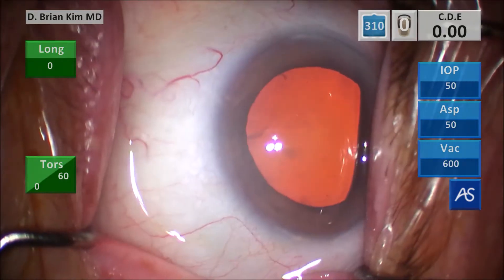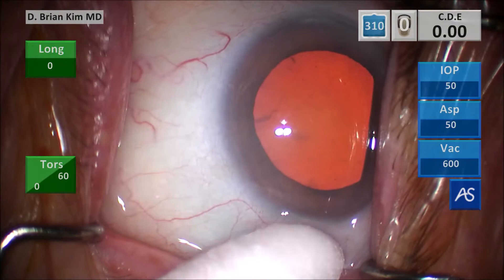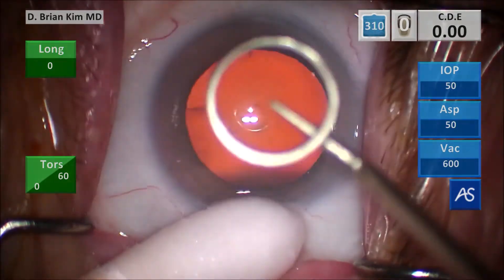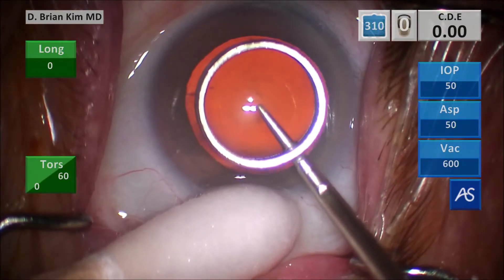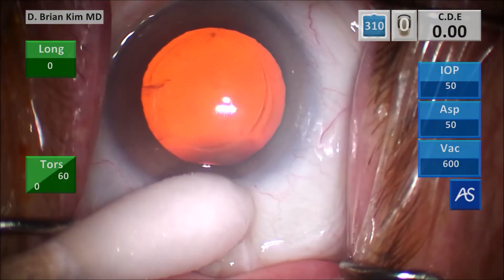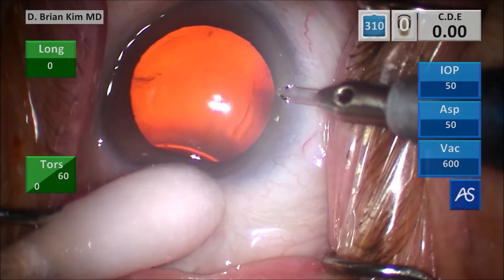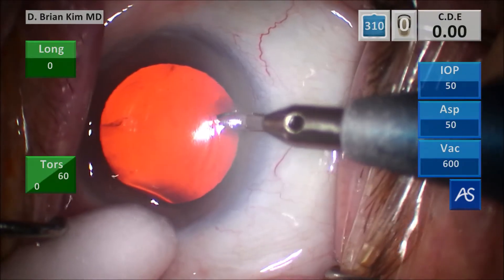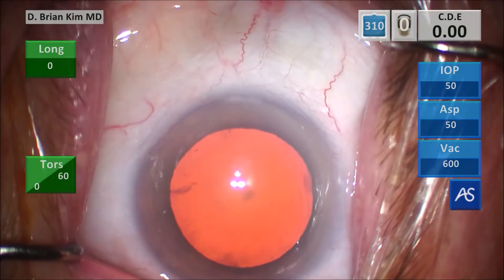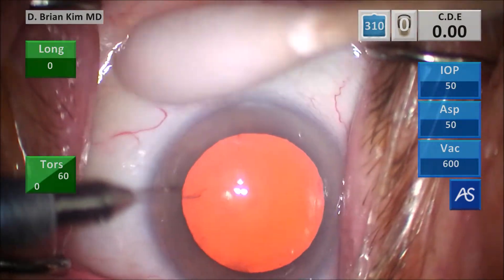This is the left eye. You can see the strong Bell's reflex as well and all that pooling. I'm having the cotton tip just absorbing all that water there, and it's going to interfere with a little bit of my view as I'm doing the case. I'm holding the eye steady with the cotton tip — it's already soaked, so it's not as good at holding the eye. I mark the central cornea with my corneal marker, then I'm turning the eye down towards the left, and I make my paracentesis incision on the right side and then the left side.